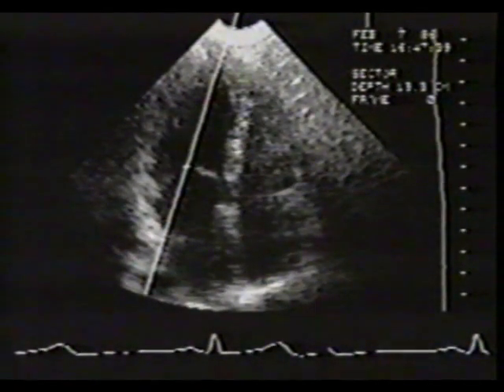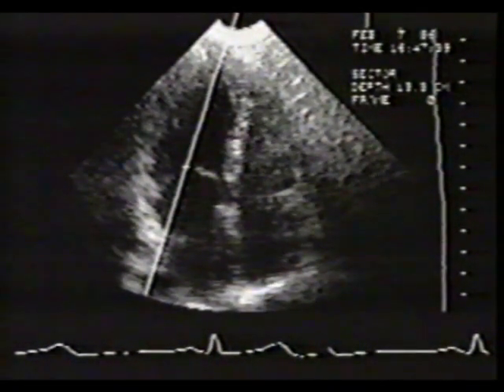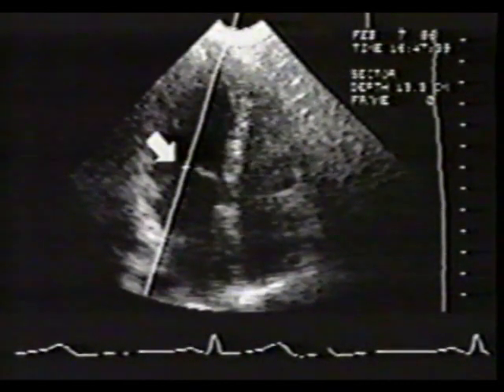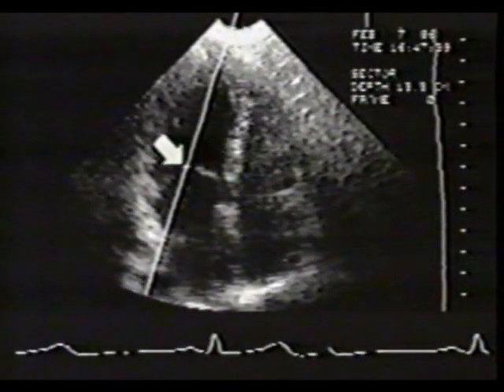We will begin the normal pulsed wave exam with a duplex transducer in the apical position. We are interrogating the left ventricular inflow profile. We would like to emphasize at the outset that the mitral inflow profile is variable in the same individual, depending on the position of the sample volume. For the sake of consistency and reproducibility, the Doppler sample volume is positioned on the left ventricular side of the mitral leaflets, close to the tips.